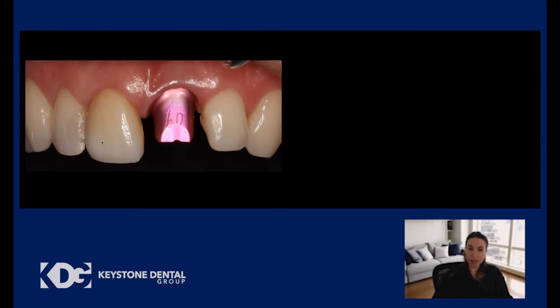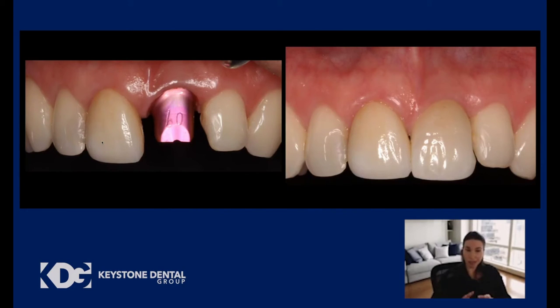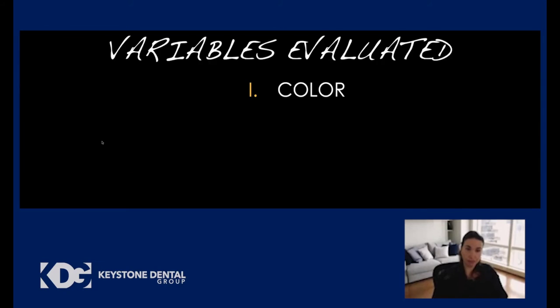It's the same identical abutment that we used first. The only difference is this abutment was anodized to appear light pink, the same as is done with the implant neck. And then we cemented the same zirconia crown. The patient again went home, came back 3 weeks after, so we evaluate the color of the pink abutment. Again, letting the patient and the soft tissue heal at this appointment.